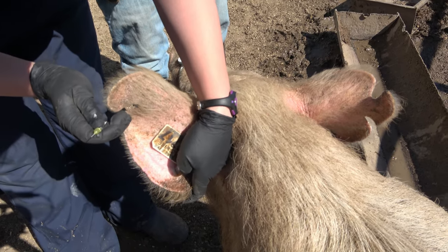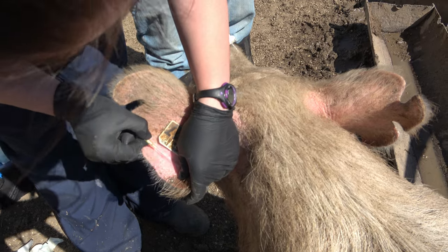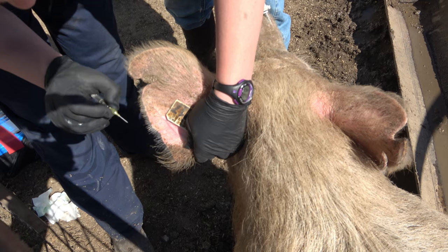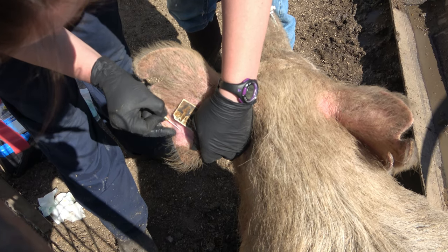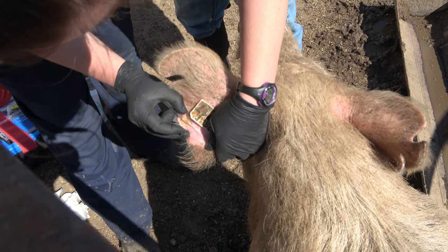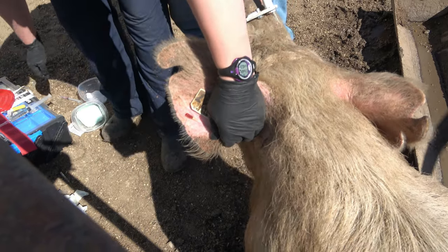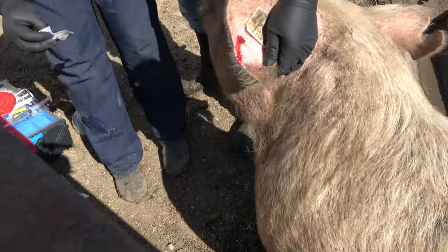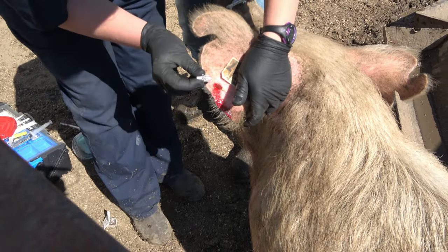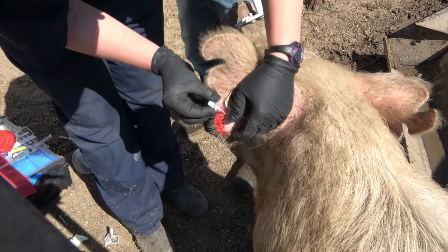All right, so I'm gonna occlude down here by the base of the ear. This is another reason why I like the right ear, because I kind of end up a little bit backwards. All right, it's a very superficial vein, so we're gonna take a nice shallow angle. I have my flash, and we're gonna go ahead and insert, and then place our cap on. So I have nice flow out of there, so I know I'm in the right spot.